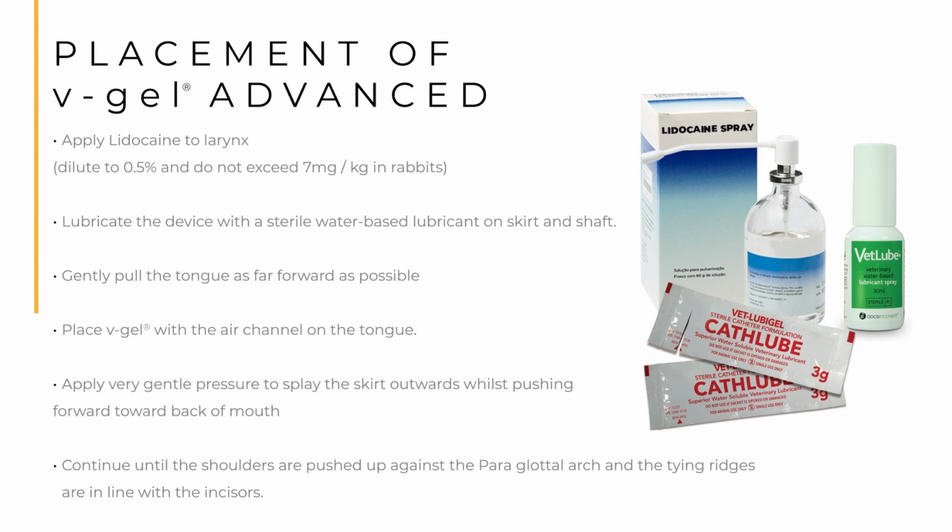Lubricate your selected device with a sterile water-based lubricant, such as the ones we have shown here. Ensure the length of the device is well lubricated, as well as the bowl. Do take care that the lubricant you are using has not occluded the airway channel.